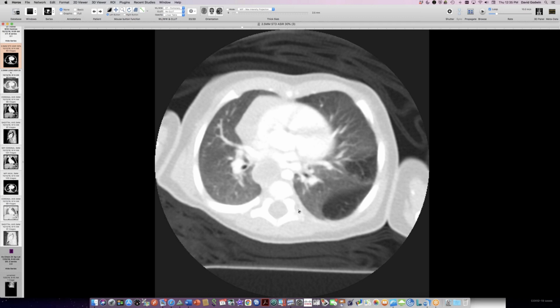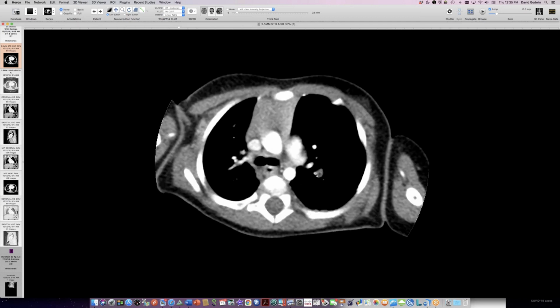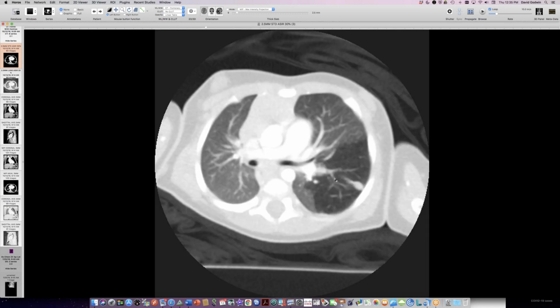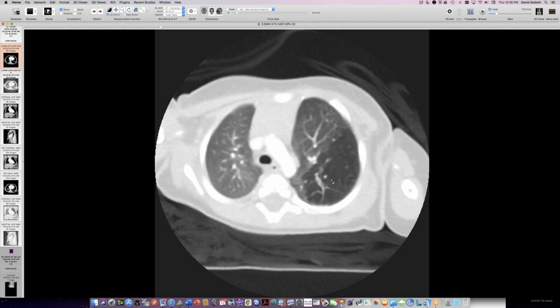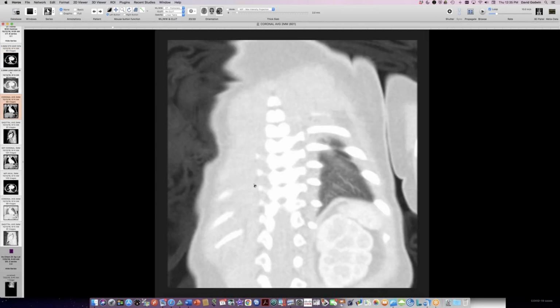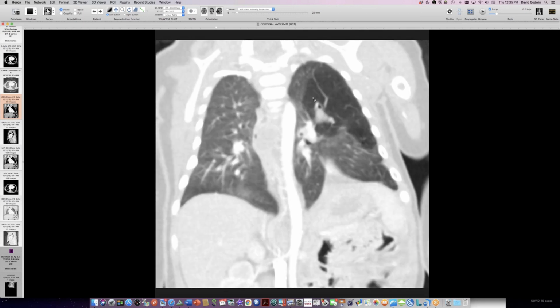And let's look at the lung, because there is a mucus plug associated with this rarefaction of the lung. So this looks to me like a bronchial stenosis. It's an upper lung distribution, but it doesn't go all the way up to the apex. It's the lateral aspect of that left upper lung. But I think this is a congenital atresia of the bronchus here with a mucus plug distal to it.